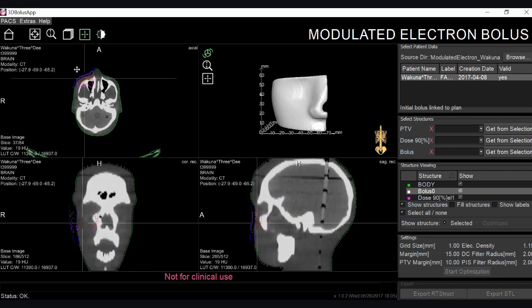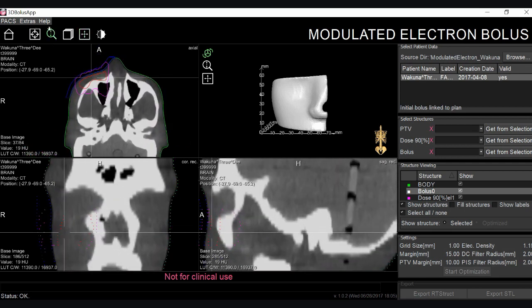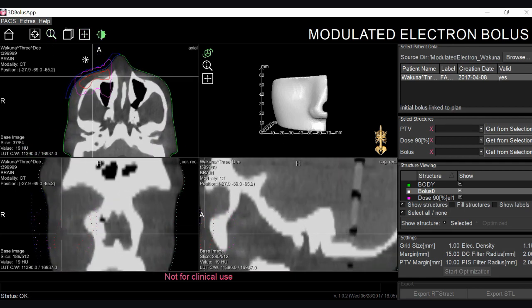Three planar views — axial, coronal, and sagittal — as well as a 3D rendering of the selected structure from the structure list are shown. Pan, zoom, and window level are also available options for the three planar views.